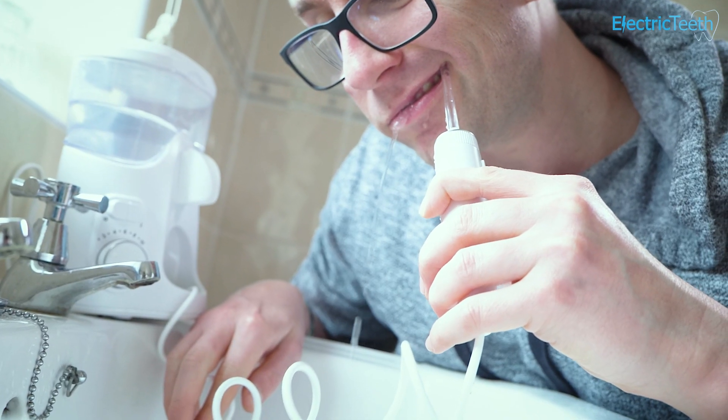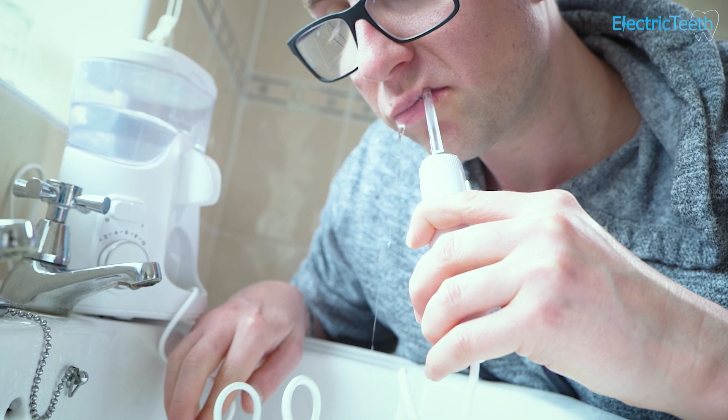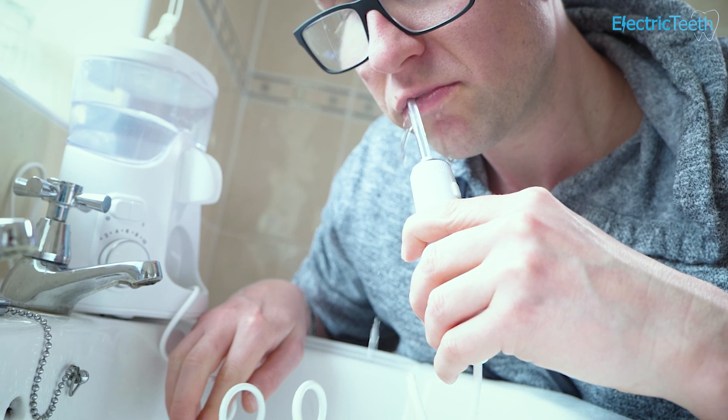It really helps maximize your cleaning ability because you're not fiddling around trying to move the handle so much — you can just rotate that nozzle. It's really easy to do and takes no effort when you're in the middle of a cleaning session.